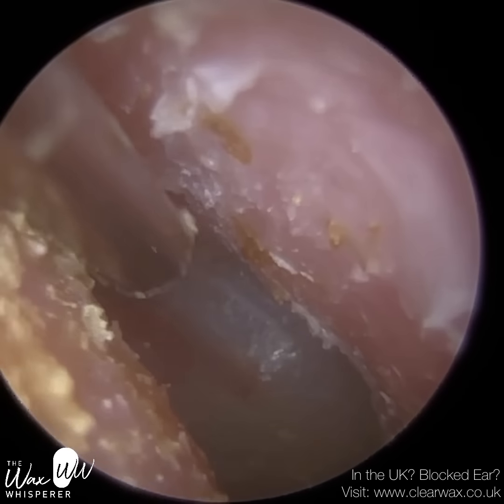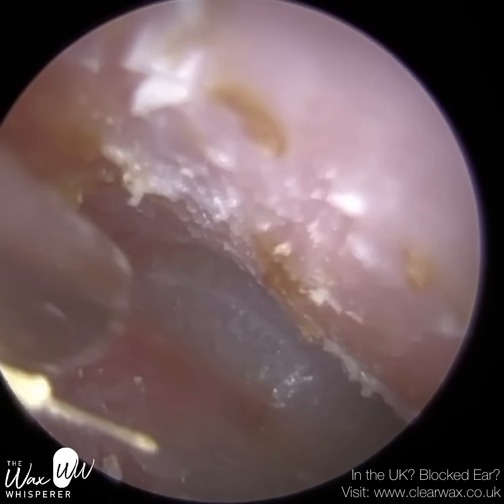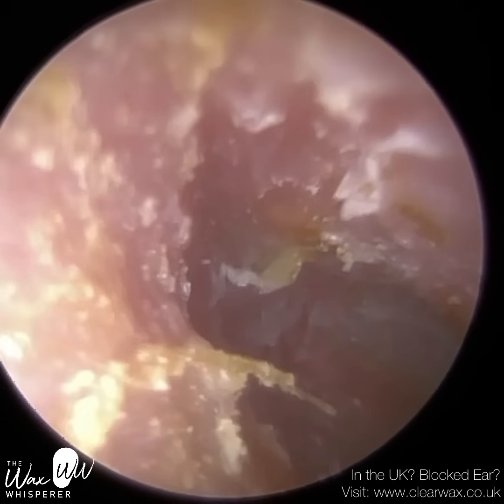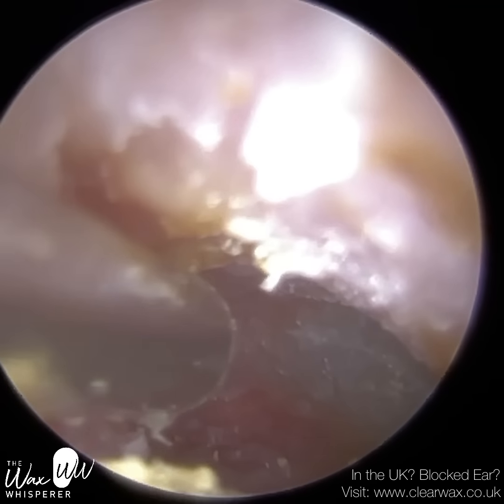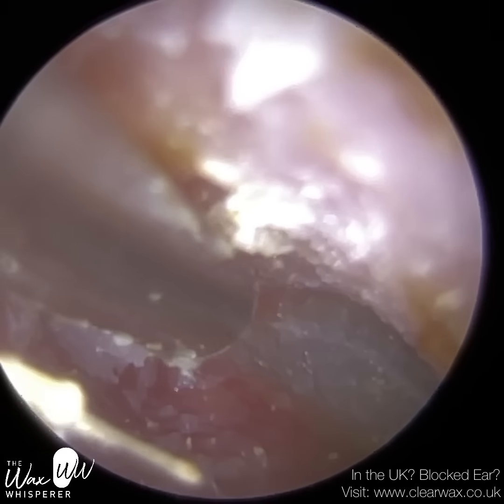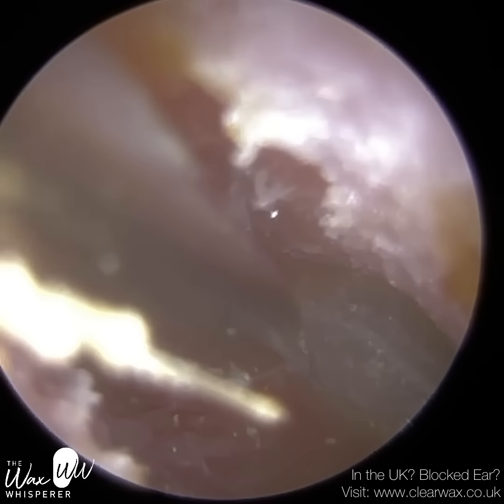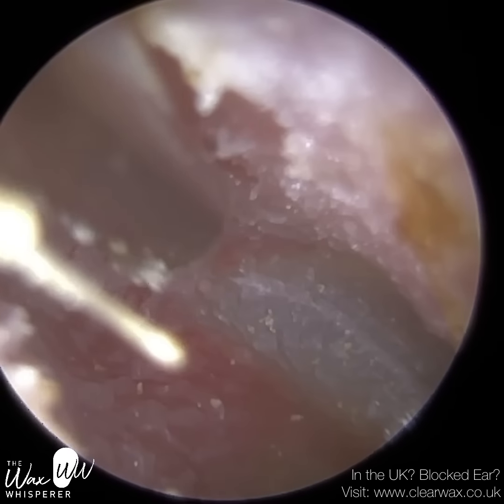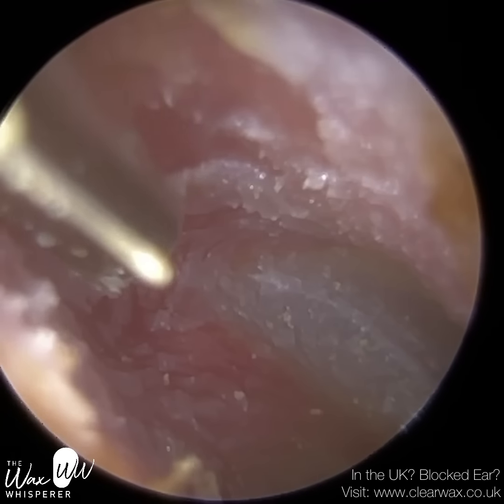And here, just right to left, just little fine motor movements. Just going back to the roof here, you've got some more dead skin. I'd say the right is a lot more inflamed and swollen than the left, but there was no dead skin on the patient's right eardrum. Upon attending, they did advise that they felt the left ear was the worst of the two, and even after I removed the majority of the wax and dead skin from the left ear, with those two layers of dead skin on the eardrum, they did feel that it was still slightly blocked. But upon removing those two layers of skin, they could hear significantly better.